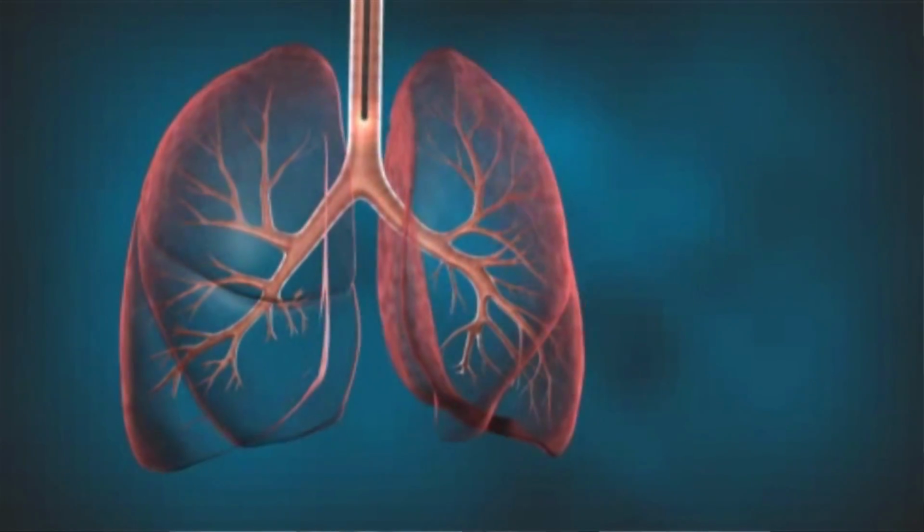Bronchial thermoplasty, then, we go down into the airways. It's done in 3 separate treatments, one that does the right lower lung, one that does the left lower lung, and then one that does both upper lungs. And they're about 3 weeks apart, so the 3 treatments are 3 weeks apart.